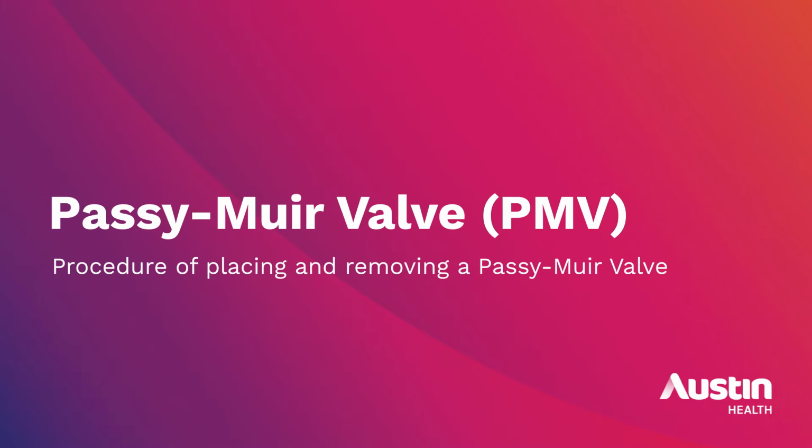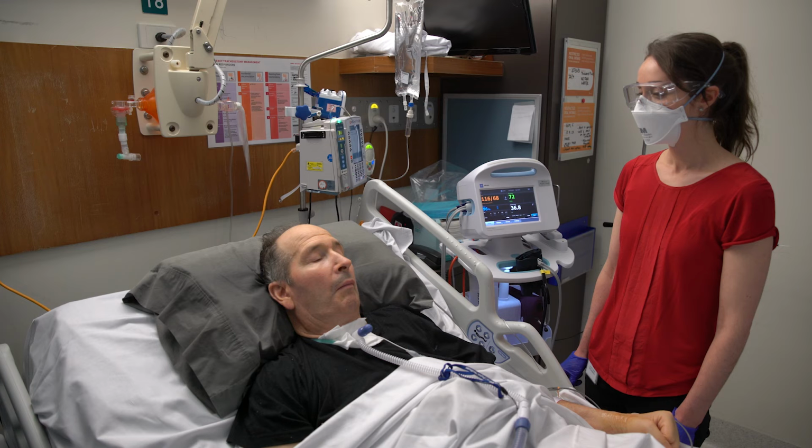This video demonstrates the procedure of placing and removing a Passy Muir valve, PMV, in a spontaneously breathing tracheostomy patient. This video should be used in conjunction with the OPIC Passy Muir Valve PMV use in spontaneously breathing patient clinical procedure, which contains detailed information regarding the procedure, as well as when not to place the PMV, when to remove it, and who can place the PMV.